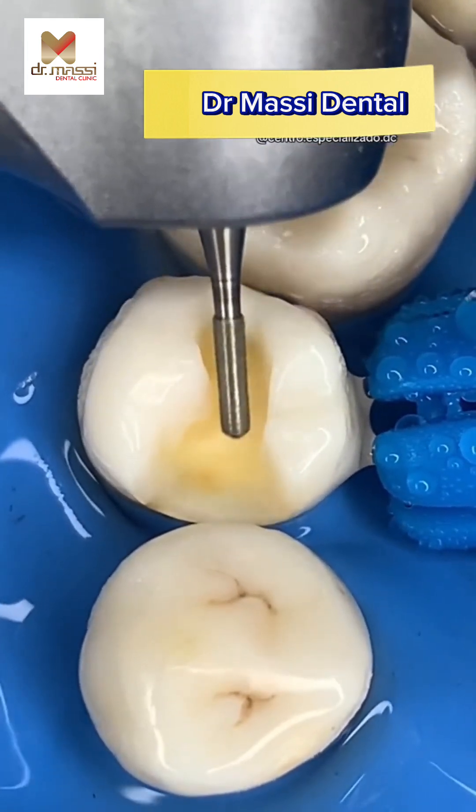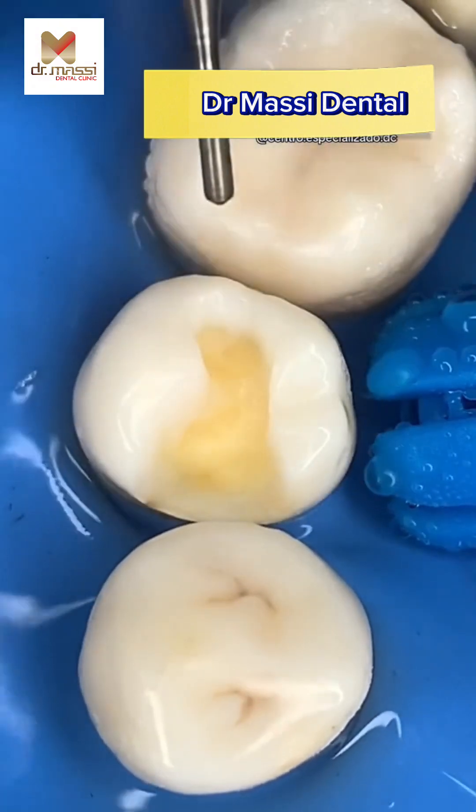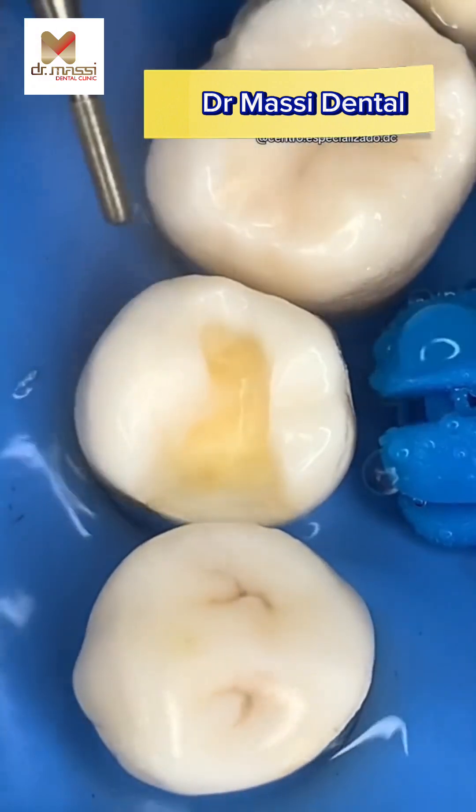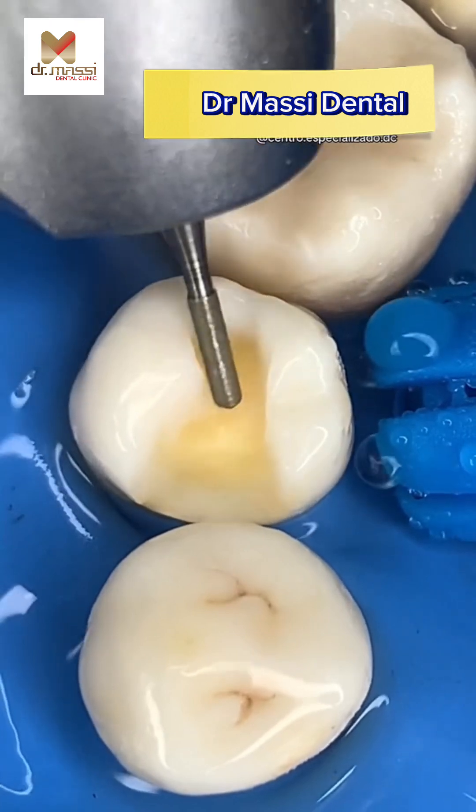Smooth the preparation with rotary instruments at high speed with water, or slow speed, or hand instruments. Remove unsupported enamel. Remove steps and ledges. Bevel the axiopulpal line angle.